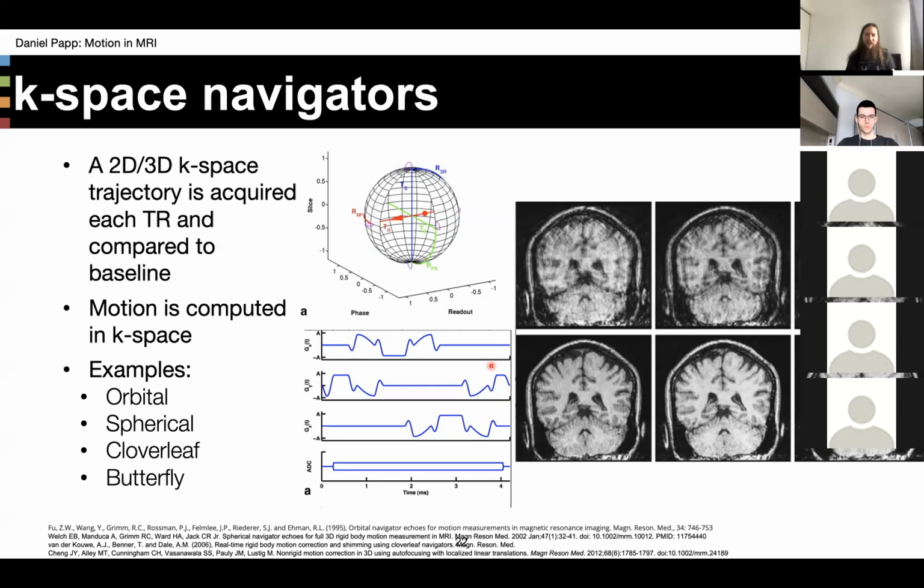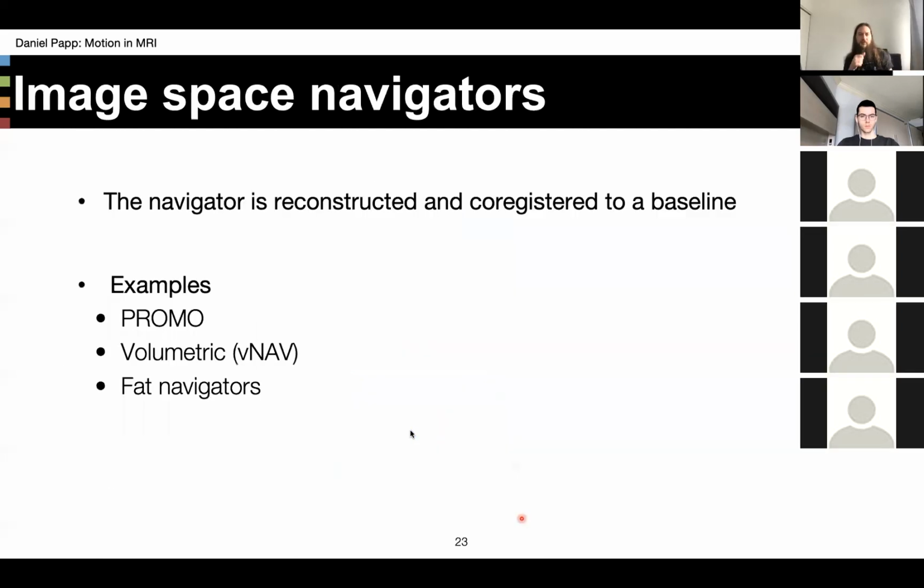But if you have that level of control, you can turn this clinically useless garbage of an image into this clinically useful non-garbage of an image. But these have somewhat fallen by the wayside. I'm guessing mostly because of this here, that you need to play out these gradients really, really accurately to be able to do your navigation.